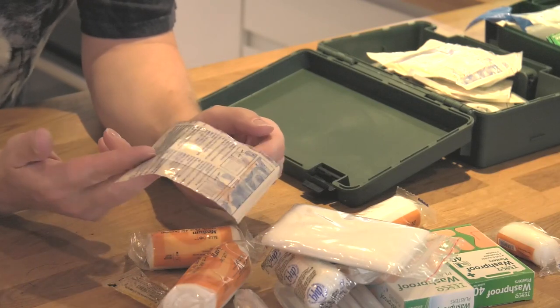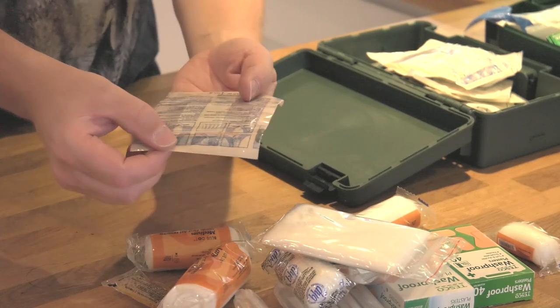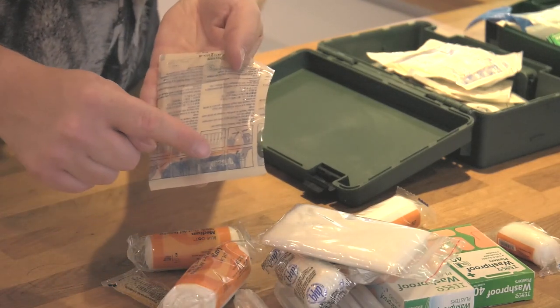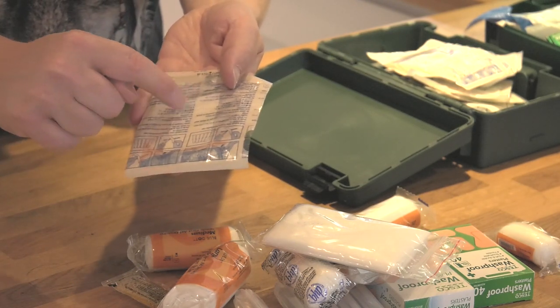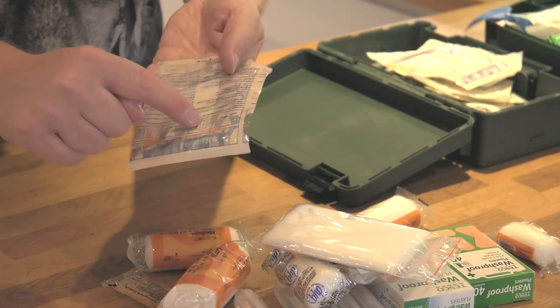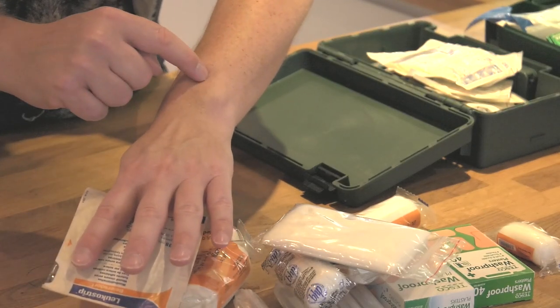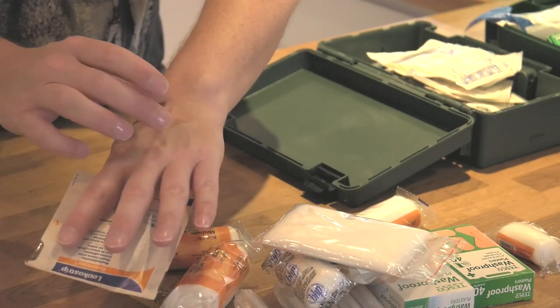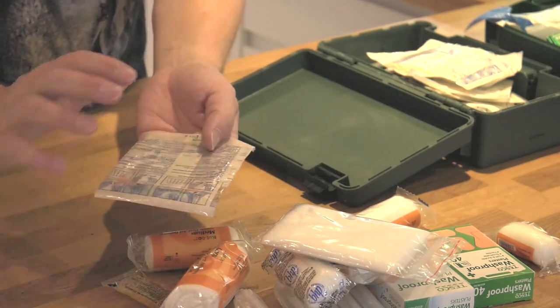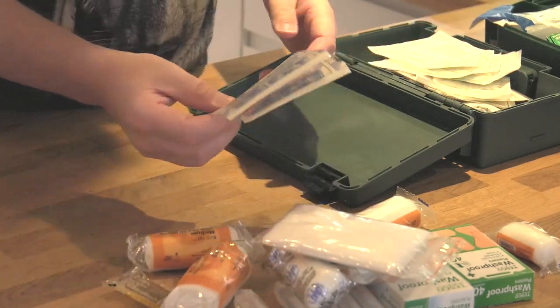Another thing I use is wound closure strips or stitch plasters. Hopefully you can see this piece of card - on it there are eight little strips of adhesive tape. These are used for, say, a quite long cut. Instead of stitches, this adhesive tape will act like stitches and you can basically keep a wound stitched together using them. Very, very handy, especially for head wounds. These are called wound closure strips.